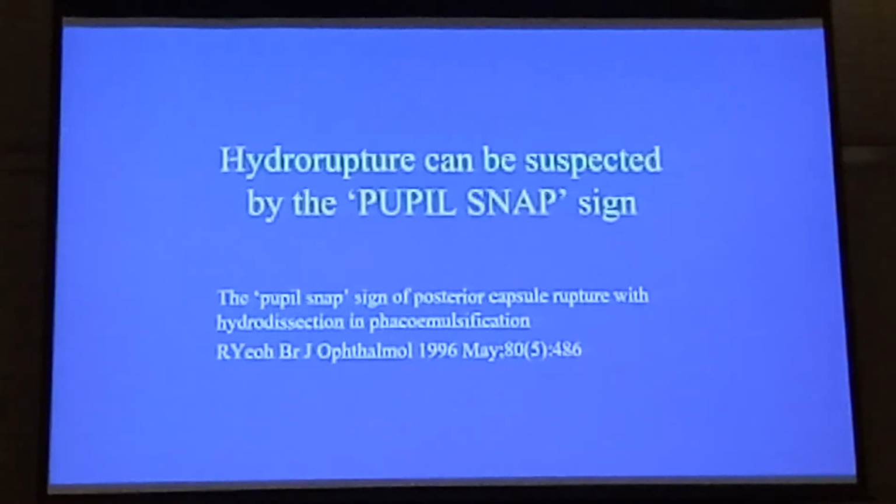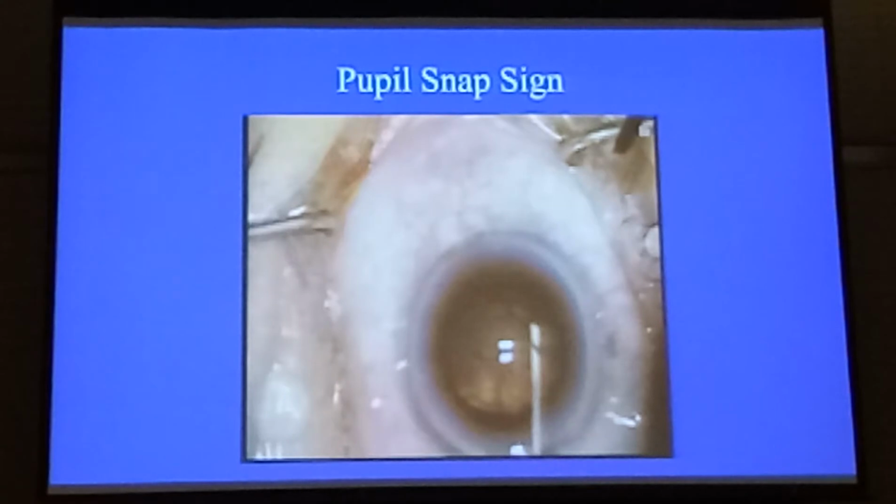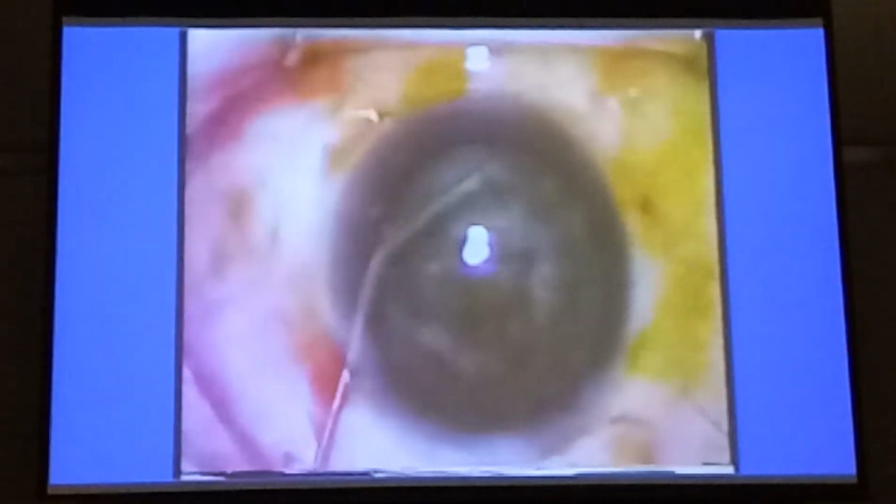Now, this is maybe occult, but you can actually suspect it's happened by this physical sign called the pupil snap sign, which I described more than 20 years ago now. What it is, is the sign of hydrodissection-related rupture of the posterior capsule, and the sign is basically that the pupil dilates at first, and then when the PC ruptures, the pupil constricts. So let's show you a clip of the pupil snap sign now.